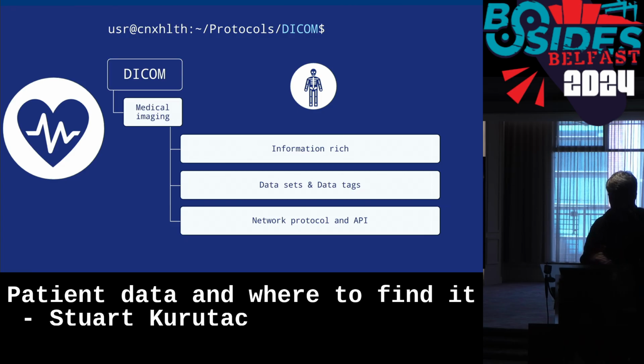DICOM. So DICOM is a standard as well. DICOM files would be the sort of images that you get from MRI machines, things like that. But it's not just the imaging. They have a load of metadata in there. These are like data sets, which are basically a huge amount of data that's separated into individual elements called data tags. The standard also describes a network protocol and an API as well. So it's not just about the construction of the file itself, it also describes how to send those files across the network.